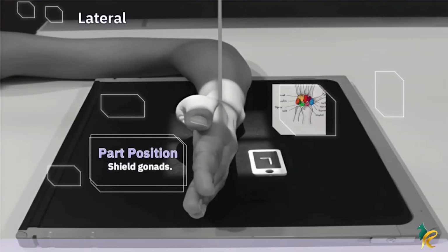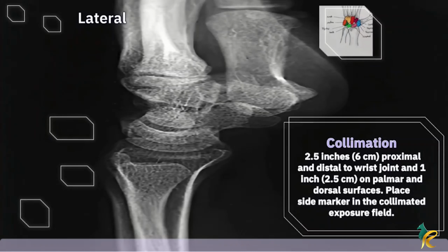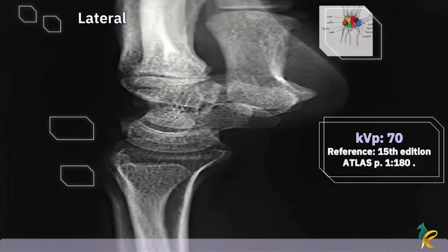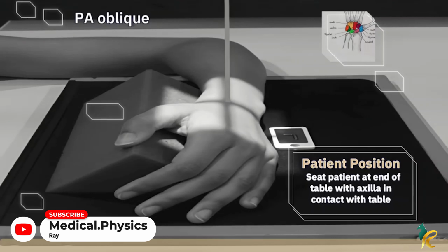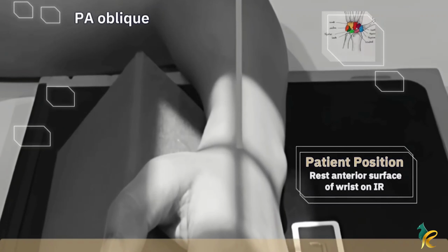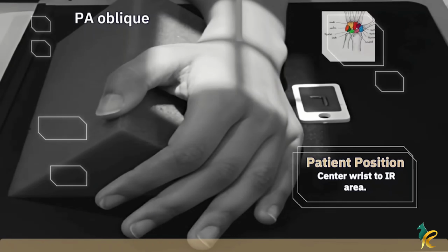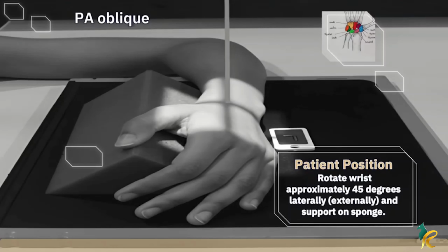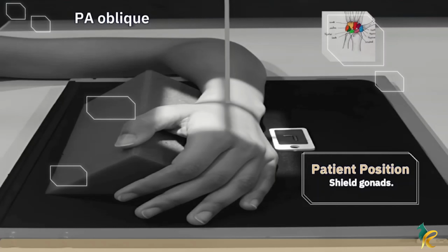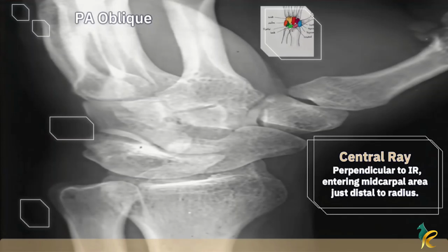Our collimator is the same as the previous technique, but our kVp is slightly higher, at 70 kilovolts. In PA oblique or lateral rotation imaging of the wrist, the patient must be seated at the end of the table with their axilla in contact with the table. The wrist must be centered to the IR with its anterior surface resting on it. We need to rotate the wrist approximately 45 degrees laterally and support it with a sponge. This sponge support is optimal, but not necessary. Our central ray is perpendicular to the IR and enters the midcarpal area. We have the same collimator setting as all previous techniques, and our kVp is 66.